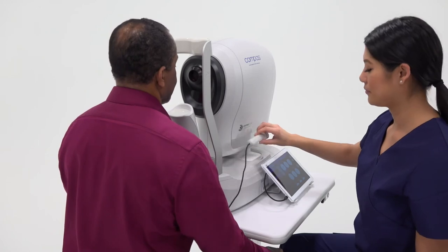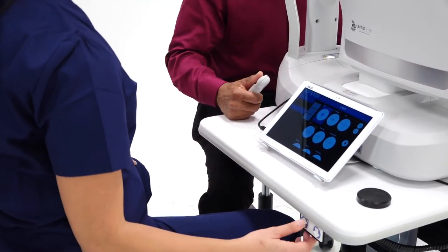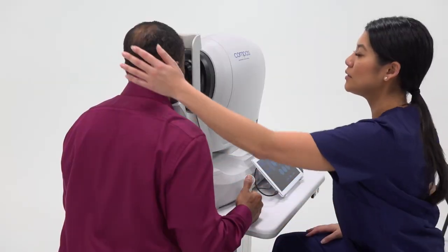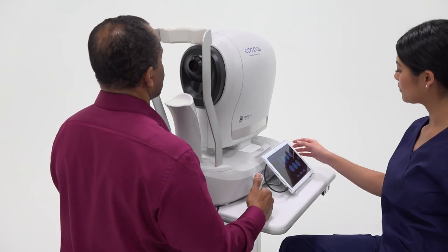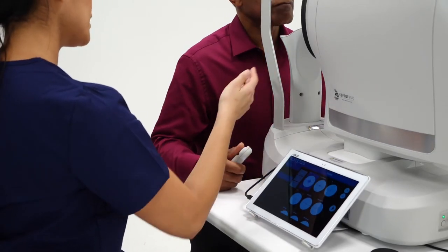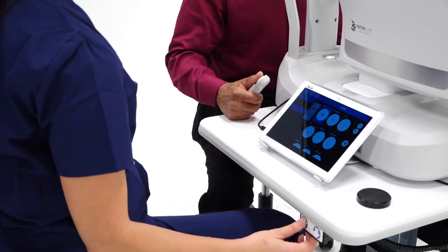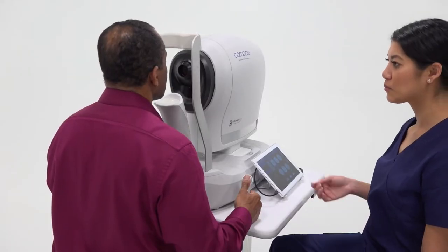Provide the patient with the patient response button. It is now time to properly position the patient. Be sure to place their chin forward in the chin rest and their forehead all the way forward into the headrest. The chin rest height is adjusted using the up-down buttons on the tablet. Align the center of the patient's pupil to the etching in the headrest. It is important to adjust both the table height and possibly the chair height, if necessary, to ensure patient comfort.